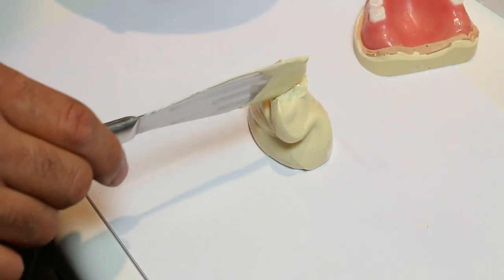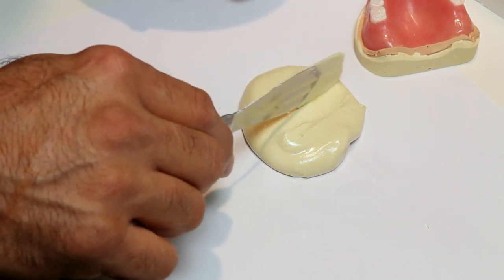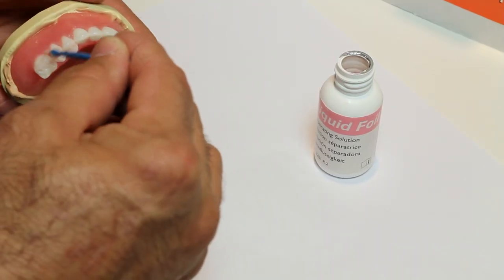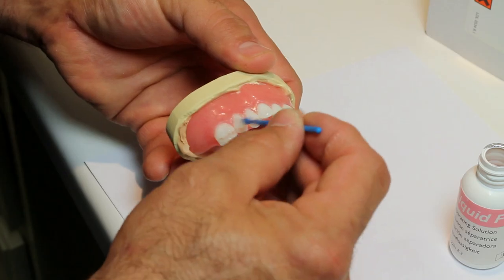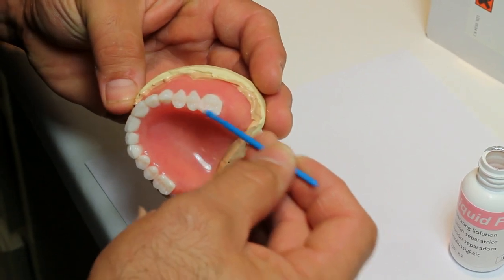With a separate pour, create a stone patty on the benchtop the size and relative shape of the denture's arch form. Note: Prior to placement, remember to lubricate the teeth with Lange's liquid foil for easy removal later.